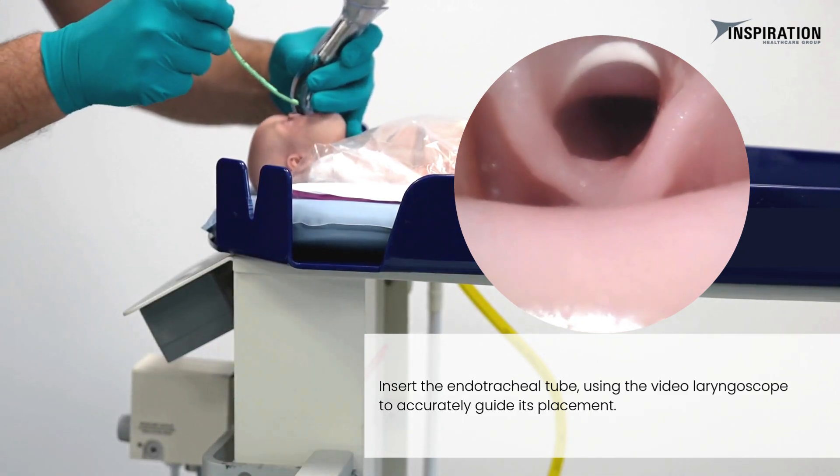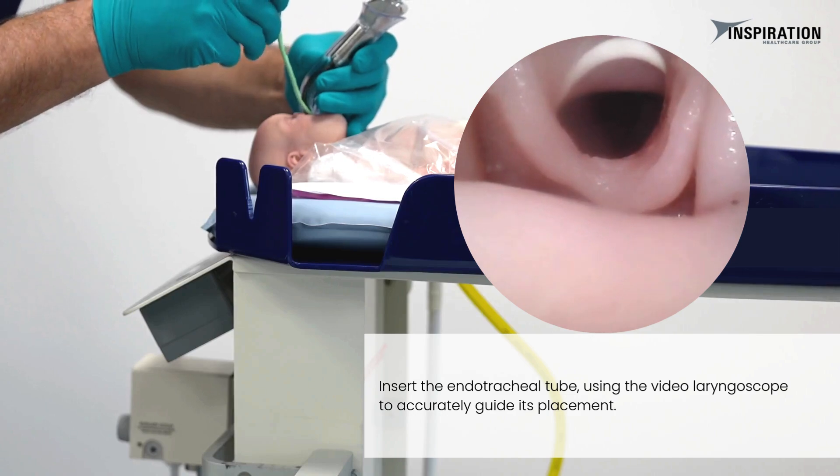Insert the endotracheal tube, using the video laryngoscope to accurately guide its placement.